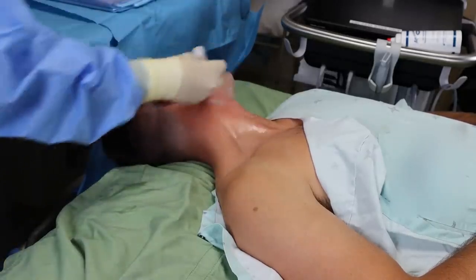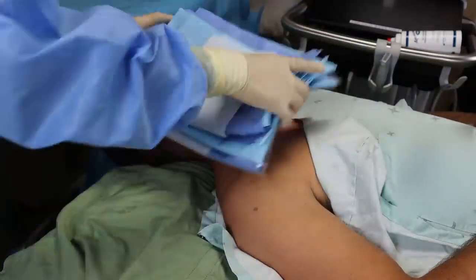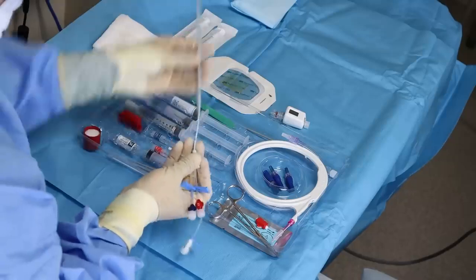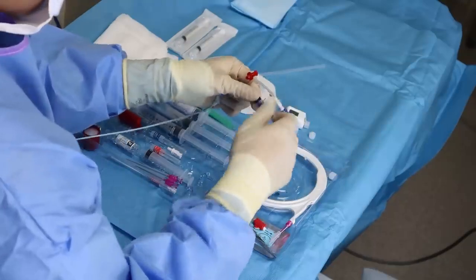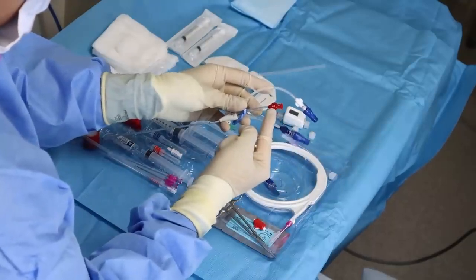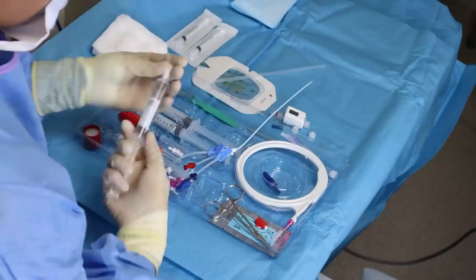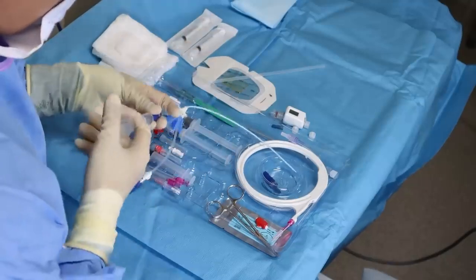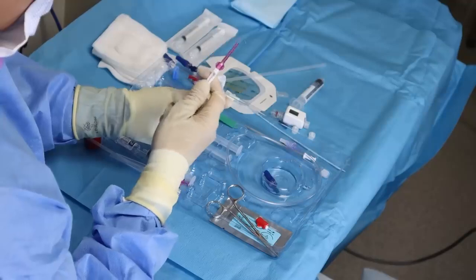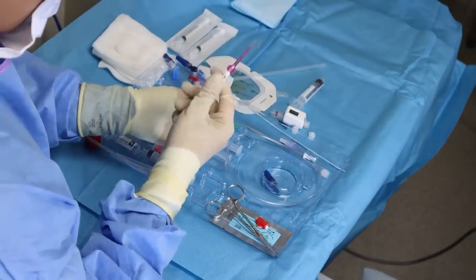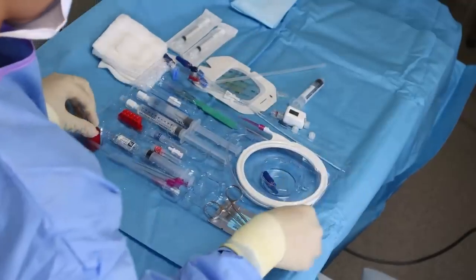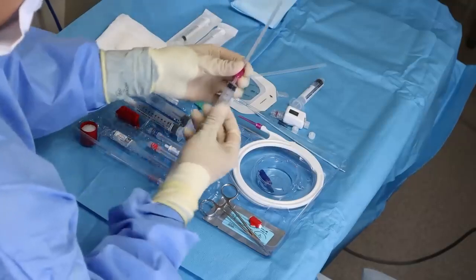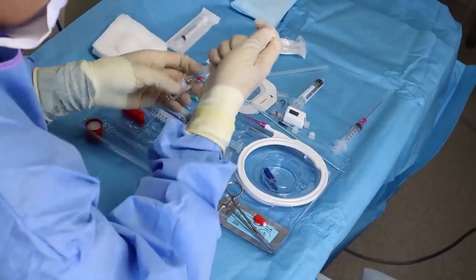Prep and drape in the usual sterile fashion. Make sure you orient the drape according to the arrows. We have to prime some of our equipment. So take the catheter and attach the blue caps to the two side ports. Leave the middle port uncapped because the wire will need to emerge from there. Flush each of the three ports generously with saline. Thumb the guide wire back and forth to ensure it glides smoothly. Then leave the wire so it is just about to emerge from the cheater cone. Attach the finder needle to the syringe. I use the long one. And then drop some lidocaine.